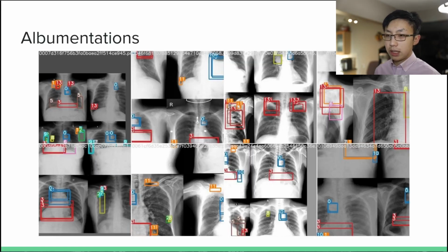As a result, we introduce rather radical augmentations to reduce the bias of our model and improve generalization. We utilize Albumentations, a Python library containing a multitude of augmentations. We use these to diversify data, avoid overfitting, and mitigate the label imbalance. We use augmentations such as shift, Gaussian blur, color, contrast, hue shift, channel shuffle, and mixup.